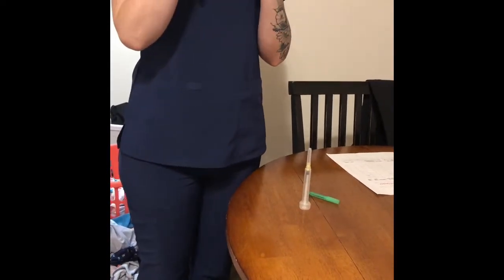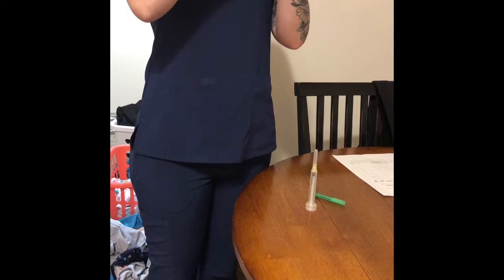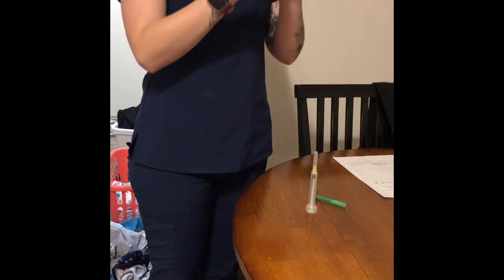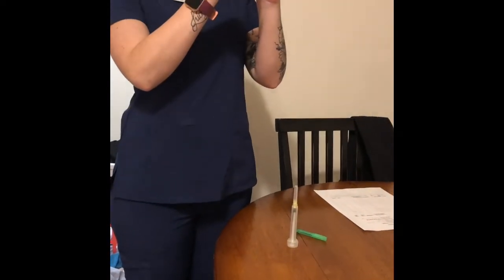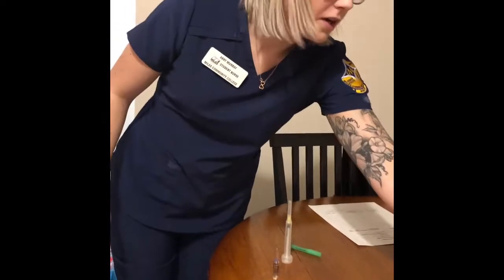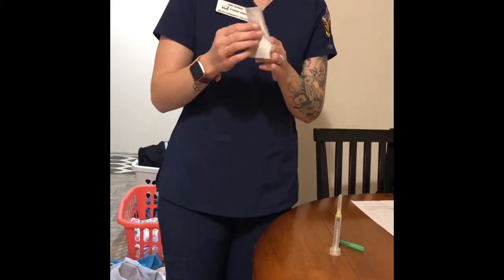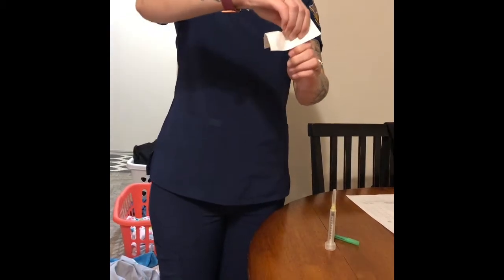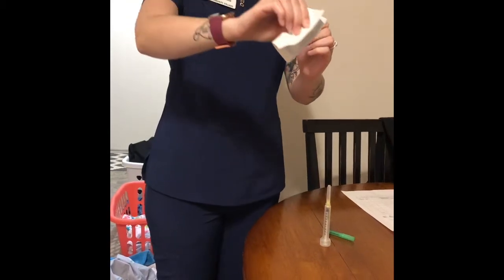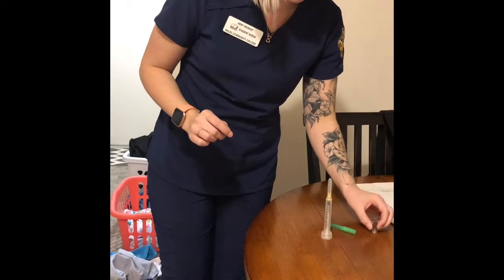Sometimes the liquid gets stuck at the top, so you can flick your wrist quickly or tap it a little bit and get the air out of the top. I'm just going to make sure that this is the right heparin dose and everything, so that's good. You want to get a gauze pad and wrap it around the top. You want to break away from yourself, and you're going to put that in the sharps container right away. You are good to set that down.